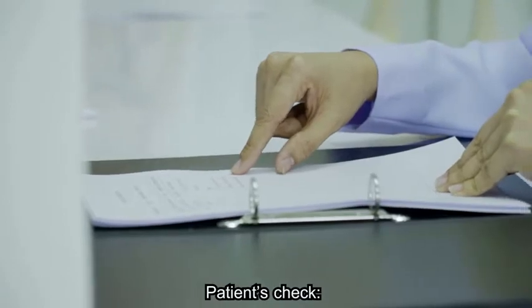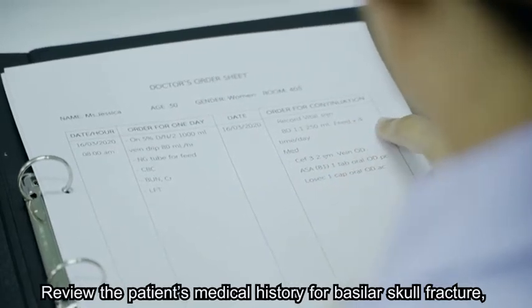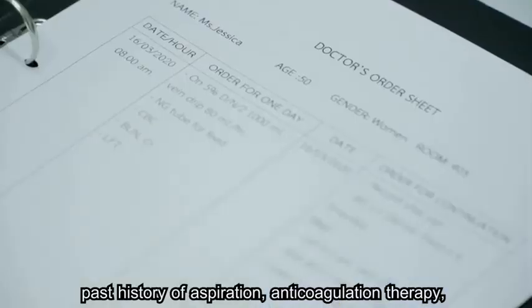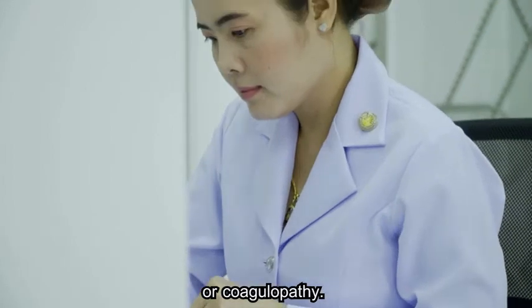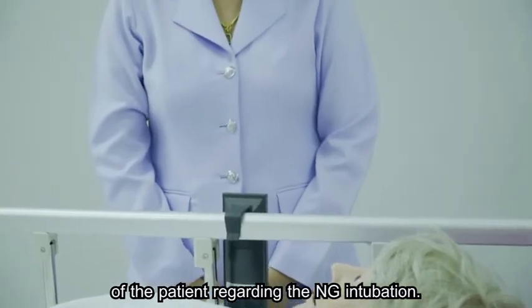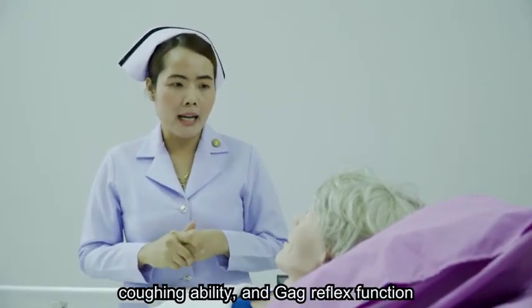Second, patient's check. Review the patient's medical history of basilar skull fracture, nosebleeds, oral and facial surgery, facial trauma, nasal septum deviation, past history of aspiration, anticoagulation therapy, or coagulopathy. Third, knowledge check. Assess the knowledge and understanding of the patient regarding NG intubation. And finally, ability check. Assess the patient's emotional state, coughing ability, and gag reflex function.